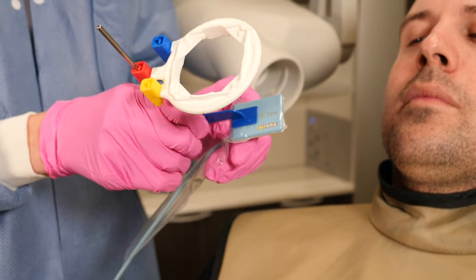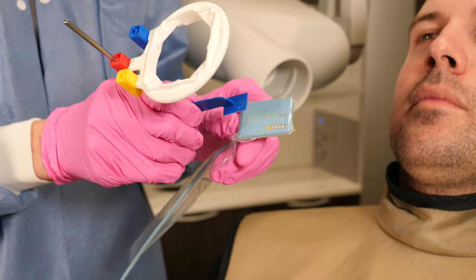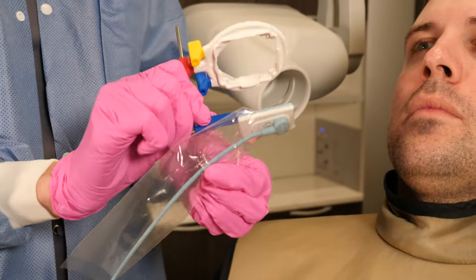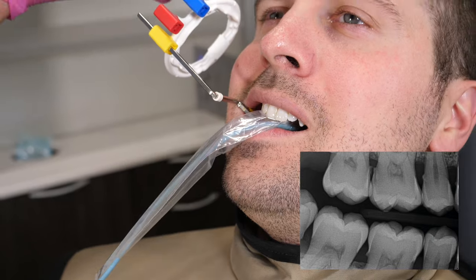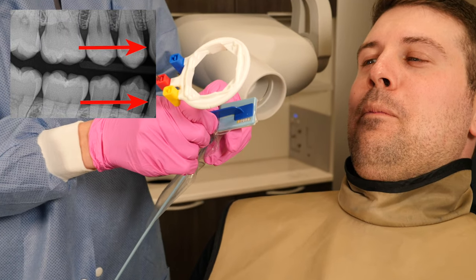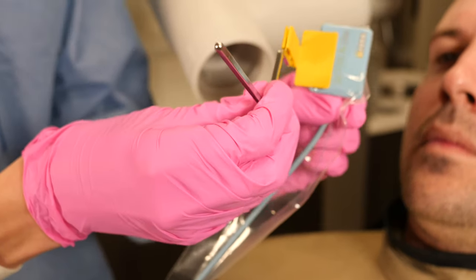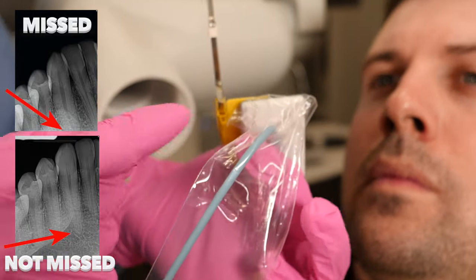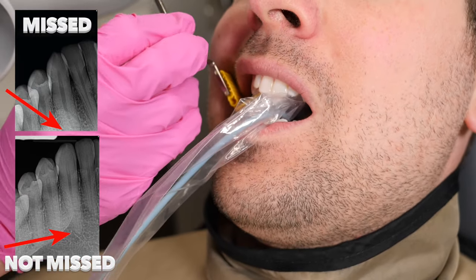You can also move the tab on the sensor itself — I've found this helpful as well. Moving the tab forward on the sensor all the way can help get far back to the most posterior molar on a PA or in the molar bite wing shot. Moving the tab backwards all the way to the back can help get the distal of the canine in your premolar bite wing shot. One more thing you can do with the sticky tab is to lower it down so you don't miss the apex of the root — part of it will actually be hanging off of the sensor itself. I've found this really helps when I'm struggling to get the apex of the root on a PA.